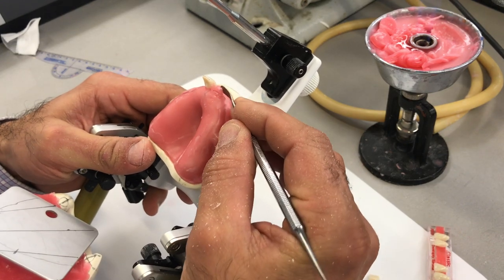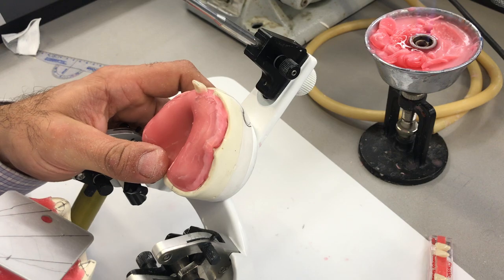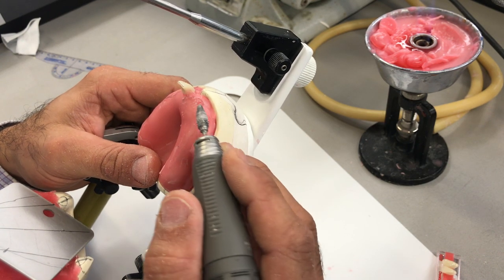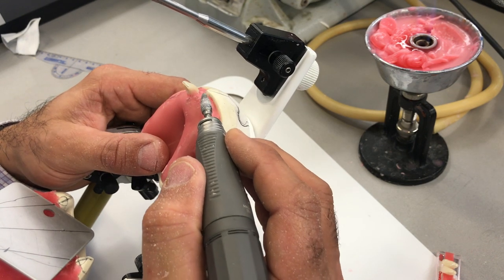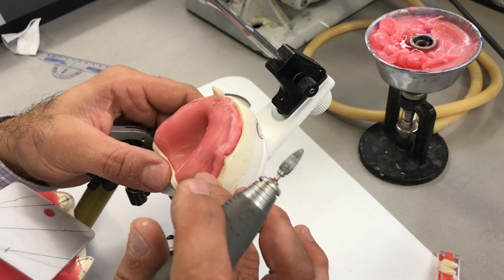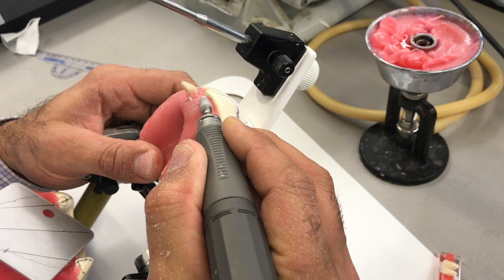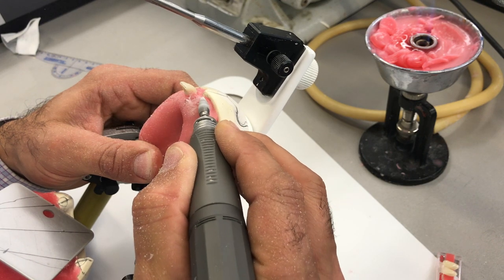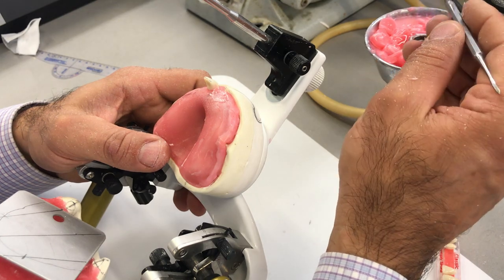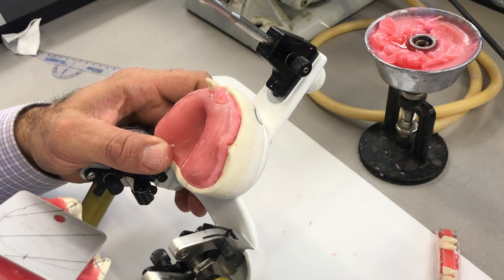I'm going to remove some of this wax and for good measure reduce a little bit of the base plate. You've got to be careful — if you're already thin and think you're going to perforate the base plate, you'll damage the cast. I think I have sufficient thickness and just want to reduce maybe about half a millimeter. In the event that you're getting really close to the cast, remove it off the cast and trim the base plate off the cast, not to damage the master cast. Now I think I have ample space to position this central a little more lingually.